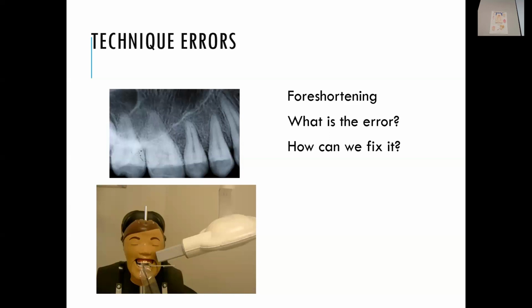Now, if your film is too flat, then sometimes what you end up doing is the picture actually stretches. So you have your beams going in the opposite direction, and it'll stretch it from one part of the film up higher in the film because of the direction of the beams.